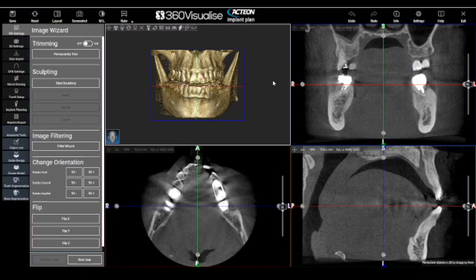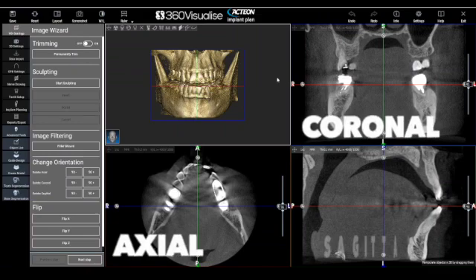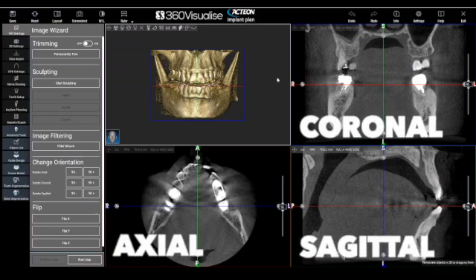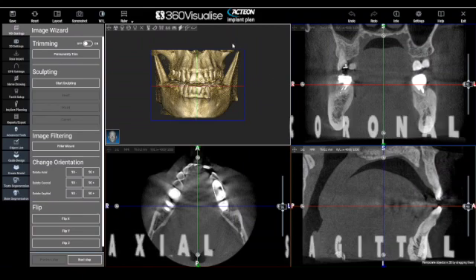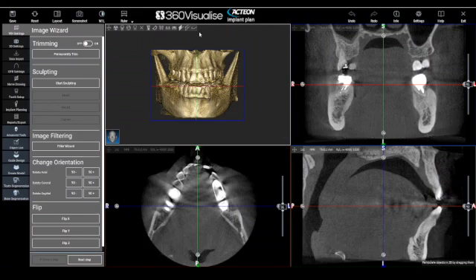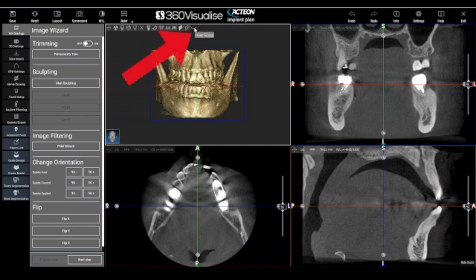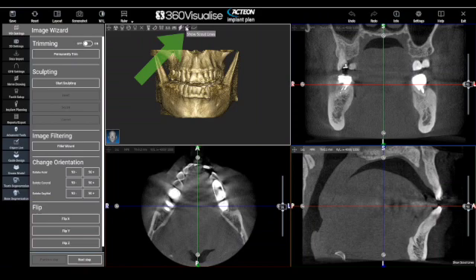The red, blue and green lines represent the axial, coronal and sagittal views. We can hide these scout lines using this button here, and show them by clicking this button.